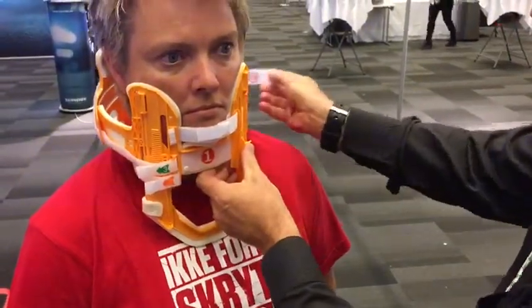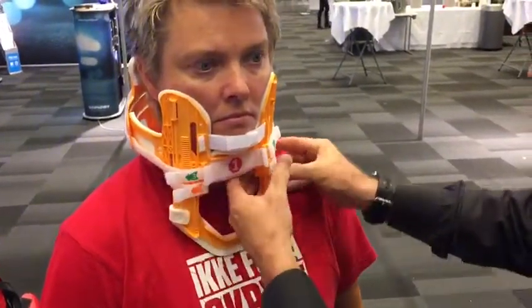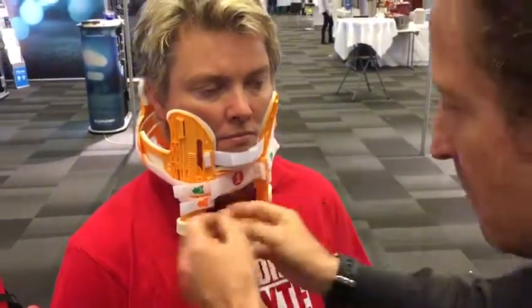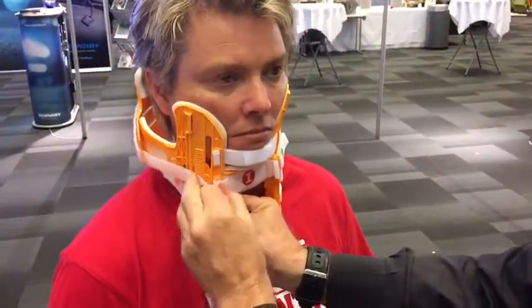Then we follow the steps. We have straps with numbers and I follow strap one. Then strap two is bilateral — left and right. And strap three also left and right.